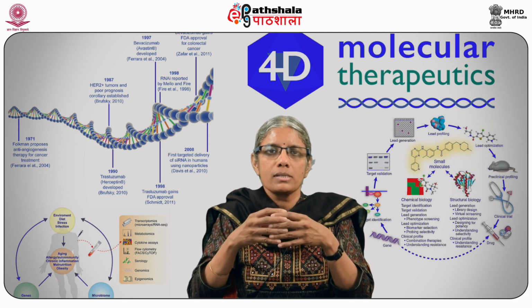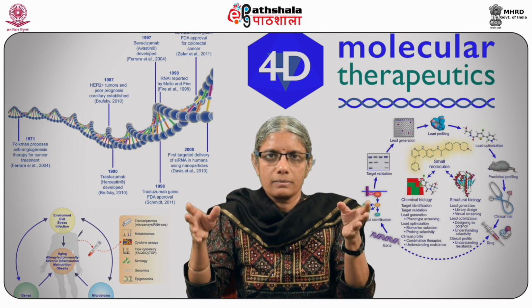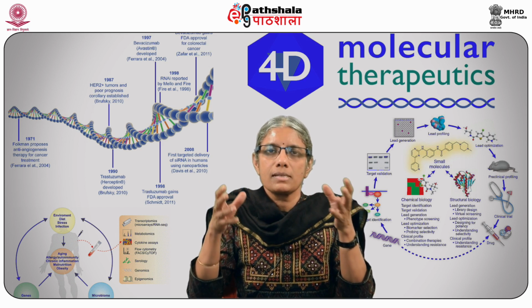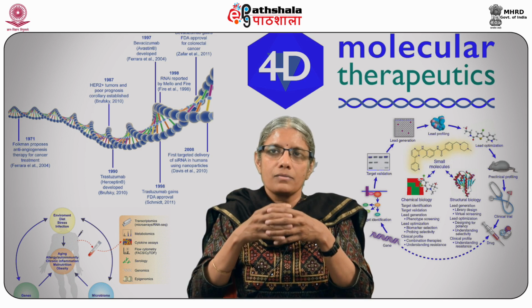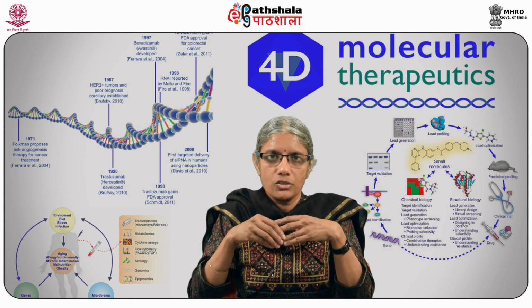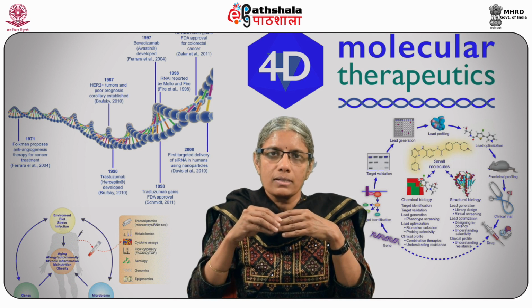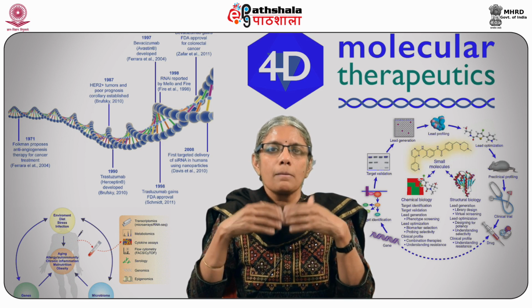Our module also discussed the different cell types and the different cell culture techniques. We discussed the different growth media, the popularly used media such as the DMEM and the RPMI, which are supplemented with 10% fetal calf serum. The medium is also supplemented with antibiotics so that there is no growth of bacteria or fungi. At times, the media is also supplemented with extra growth factors such as the epidermal growth factor, insulin, hydrocortisone, etc. to help the cells proliferate much better.